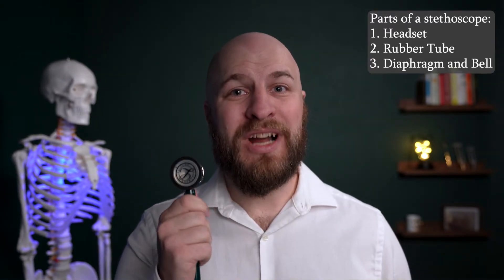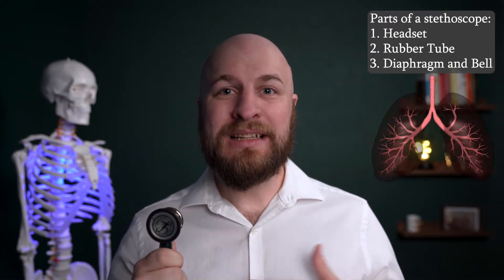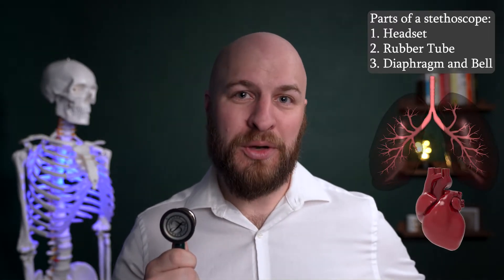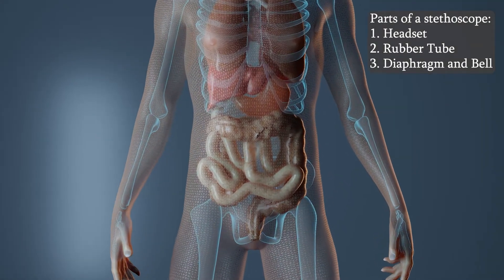The diaphragm is used for high to mid-frequency sounds. This would be things like air moving in and out of your lungs, listening to your different heart sounds at the different posts, as well as listening to bowel sounds as things move through your intestines in the different quadrants.